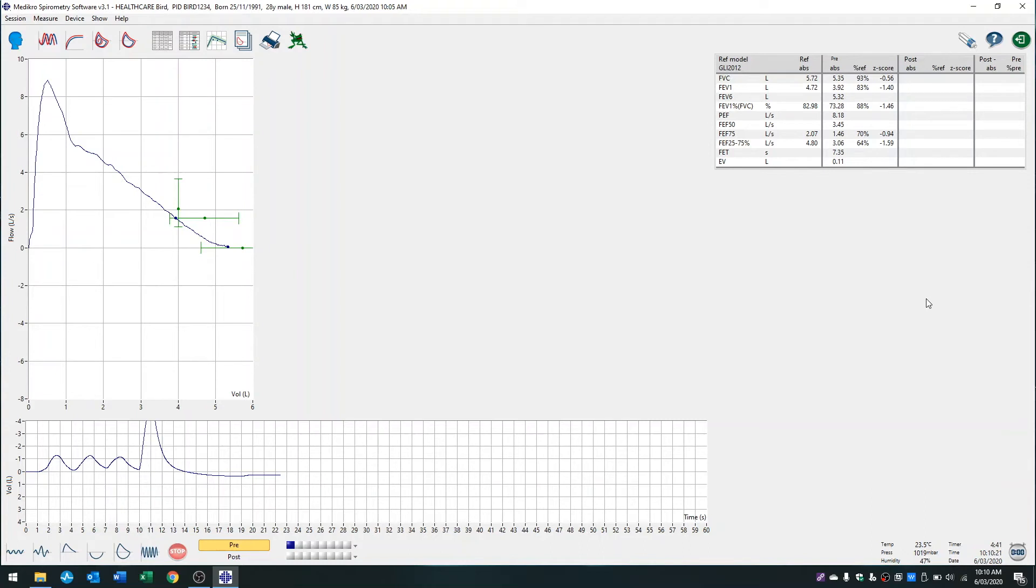I'll quickly demonstrate how I would do this today. To start the test, you want to press on this expiratory loop icon here. So I'll click on this and we'll start the test.